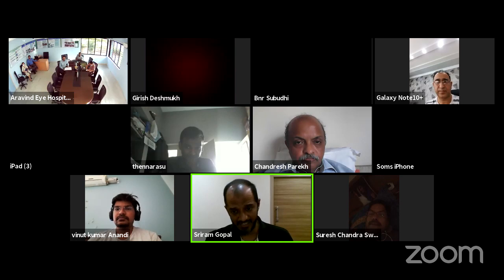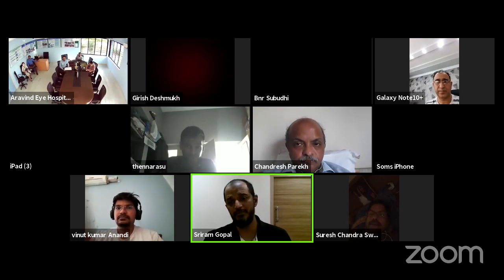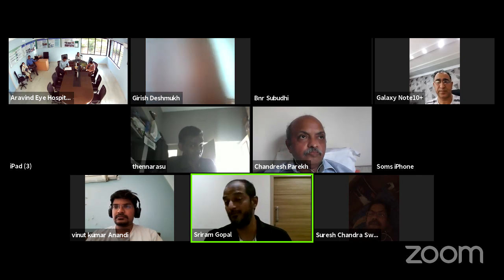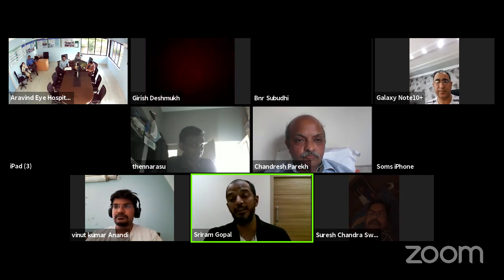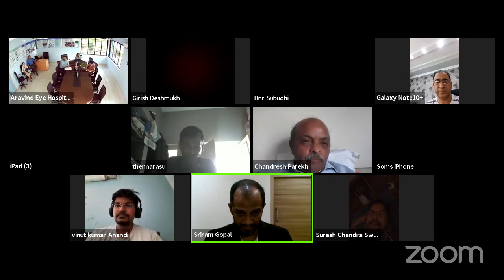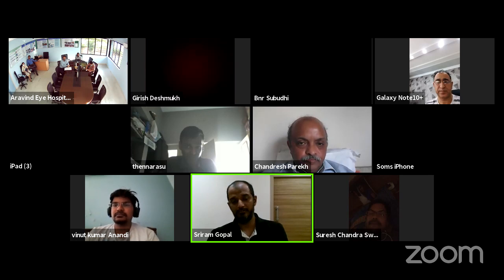What are your gain settings for different pathologies? That's pretty much the previous question. It depends on the type of pathology. So if you're looking at something which is not very highly reflective and you're finding it difficult to pick it up, you have to increase the gain. If it is something which is already highly reflective, and you want to differentiate a highly reflective from a very highly reflective pathology, at that time you have to reduce your gain as much as possible to pick up that very highly reflective lesion.